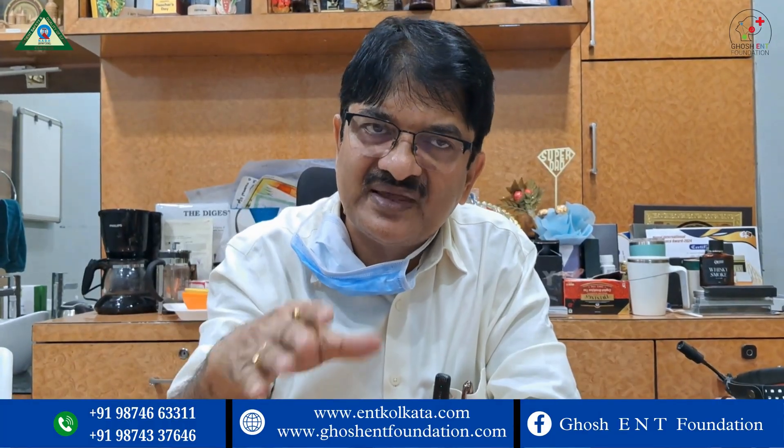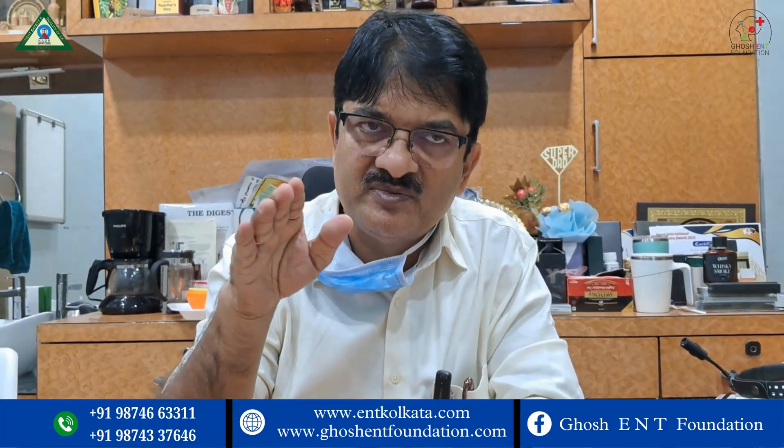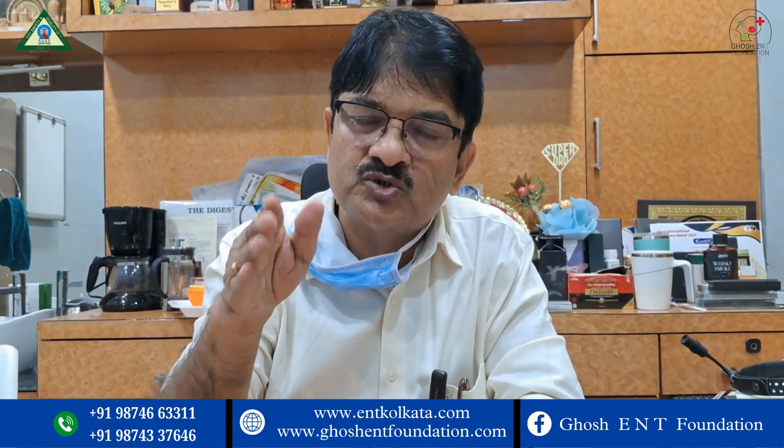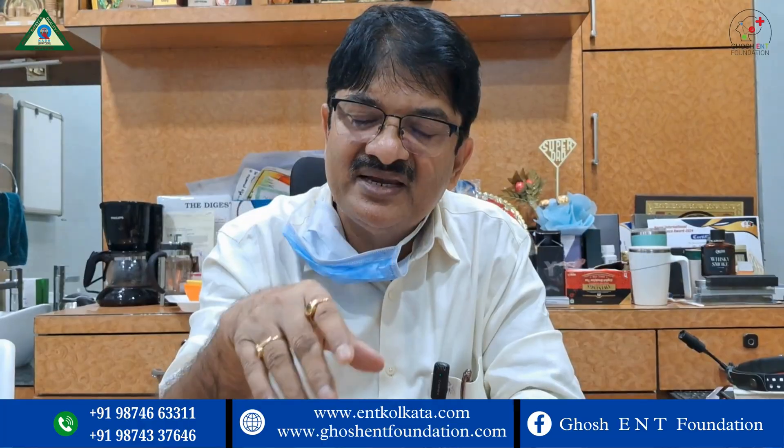You will see the turbinate hypertrophy will be reduced, and after fibrosis a very small structure will remain which will also be fibrosed. So the chance of recurrence is very, very low.